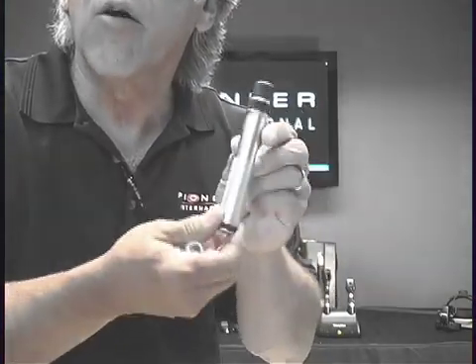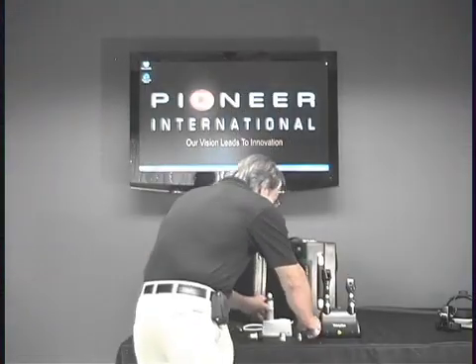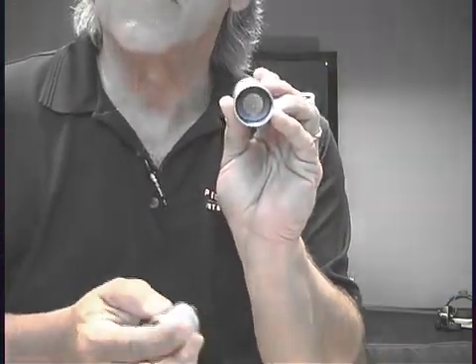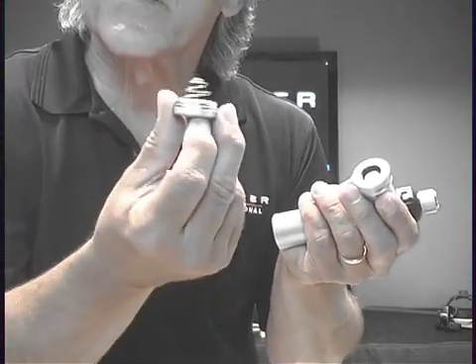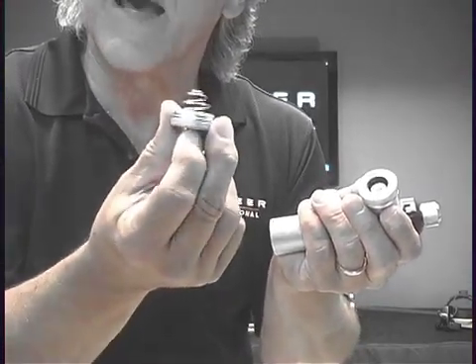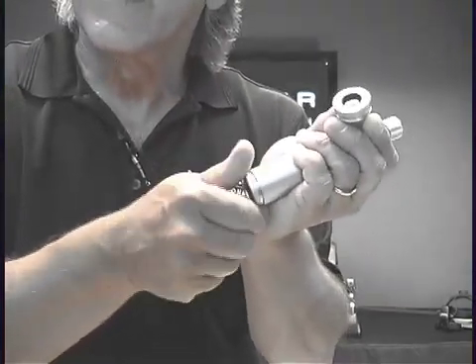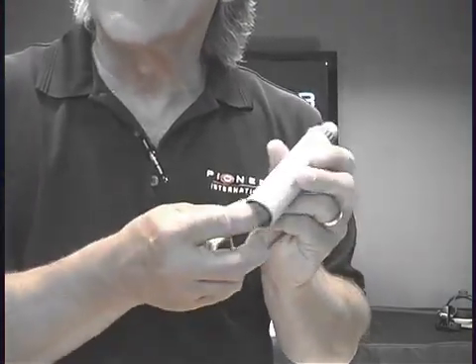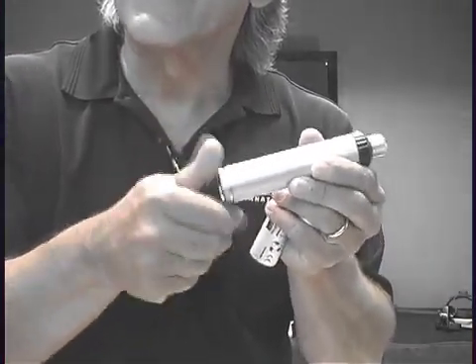On the beta NT, remove the end cap and put in a couple of C cells. Replace it with the furnished battery adapter end cap, which has a little spring on it — that will make the C cells work in your Heine beta NT handle. No need to look for any sort of adapter sleeve on the beta NT; just insert the C cells and the proper end cap with the spring, and you're ready to go on C cell power.